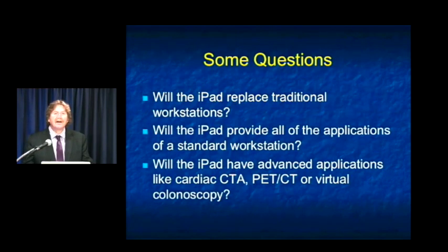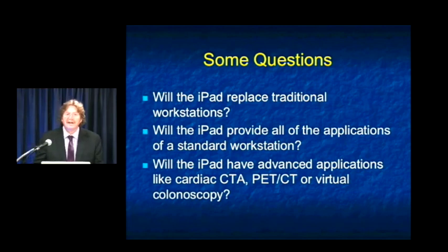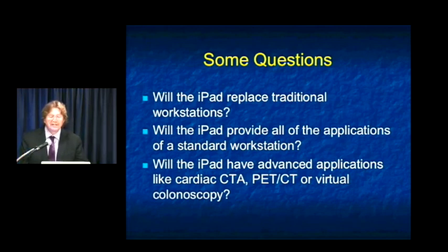Now you can ask, will the iPad replace traditional workstations? Will the iPad provide all of the applications of a standard workstation? Can it do cardiac? Can it do PET? The answer is it can do almost anything you want it to do, as long as you write the software correctly. Will it replace workstations? I don't think so, because workstations give you a lot more flexibility, including capturing images, and everything's in one place. But on a case-by-case basis, it really is a small workstation.